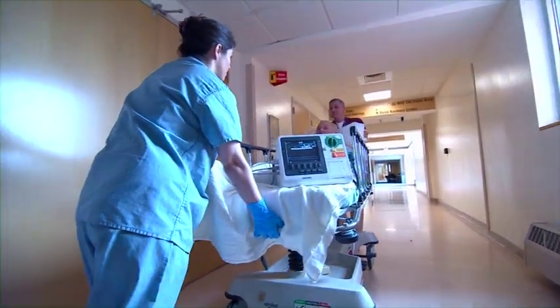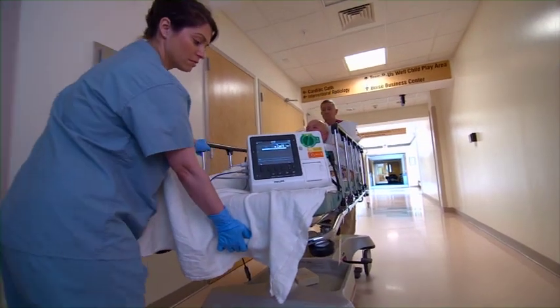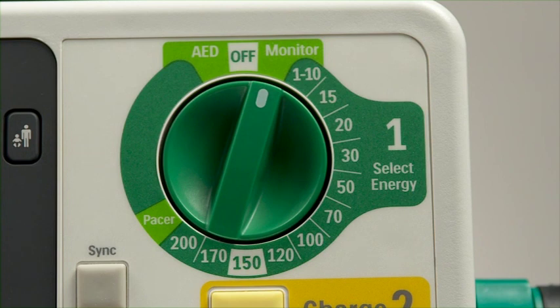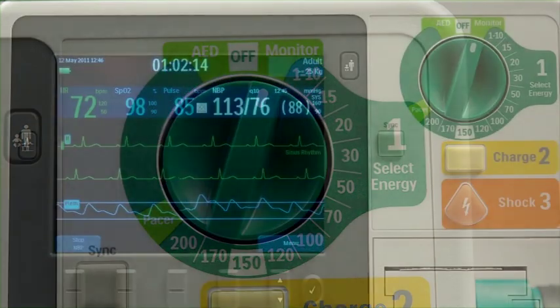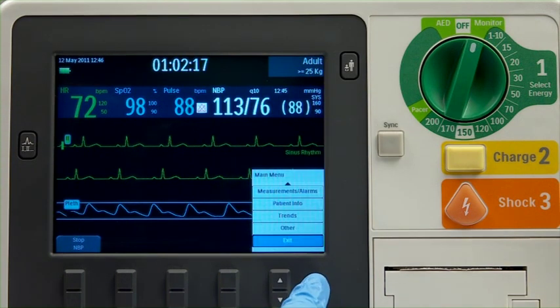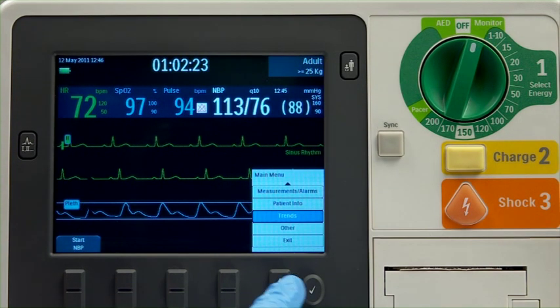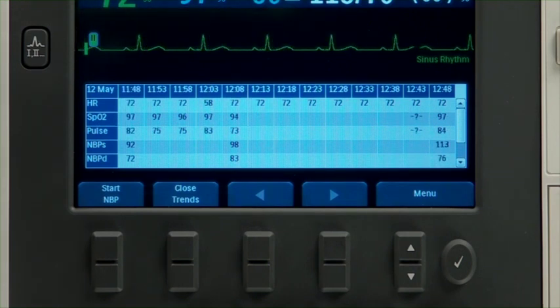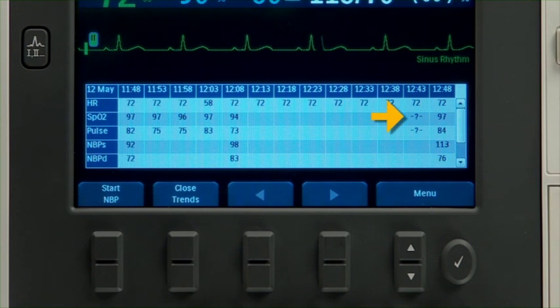The HeartStart XL Plus can store up to 8 hours of vital signs trending data for review, printing, or transmission. To view the stored trending data, the device must be in monitor mode. Press the Menu Select button, navigate to Trends, and press Menu Select. The trending report displays with the most recent data to the right and older data to the left. As new data is acquired, it displays on screen. The trending report only displays measured parameters. A symbol indicates invalid data, while the same symbol before a numeric indicates questionable data. A blank space indicates data that is unavailable.